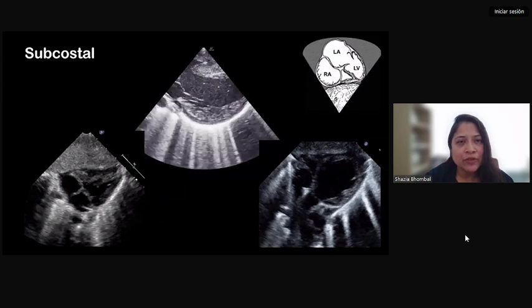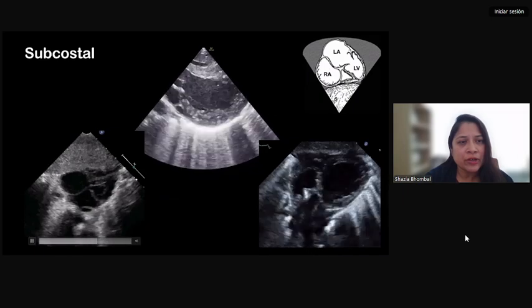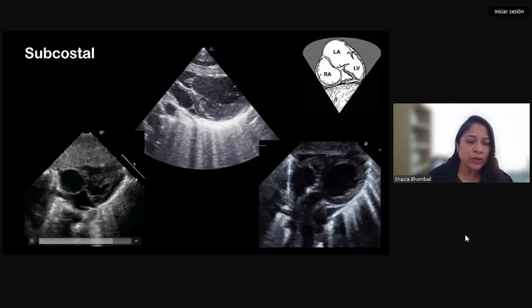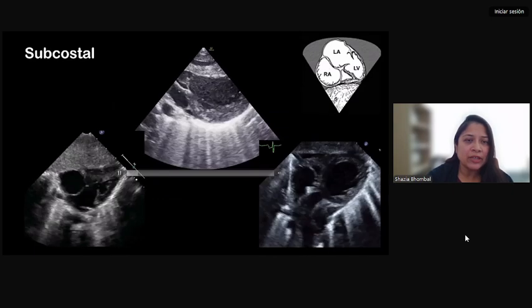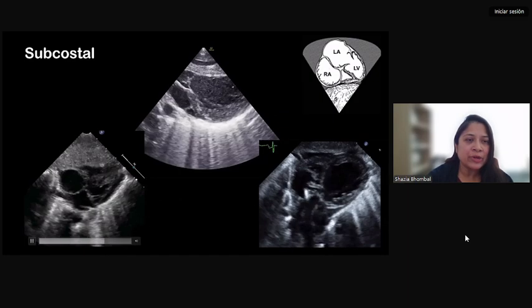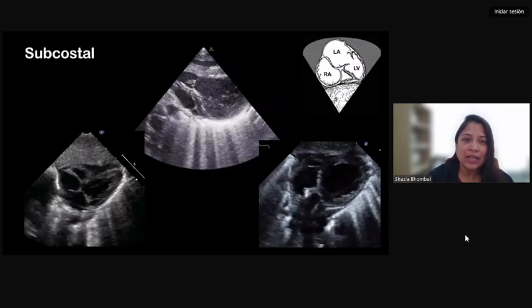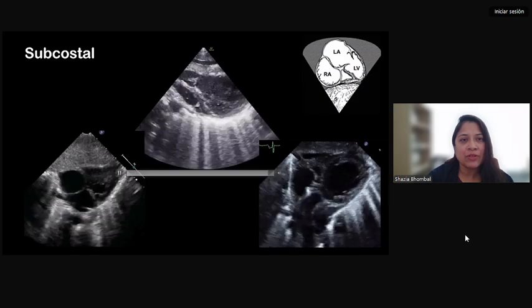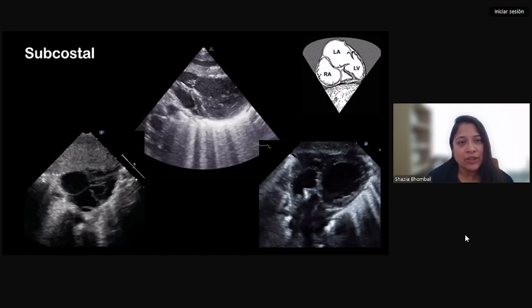And again, looking at another view, this is the subcostal view, where you have the liver here, inverted. In the cases where you are doing a quick exam, subcostal, when you're in a code situation, you can look to see, is the heart moving? These are examples of the heart not moving very well. Again, LV here, compared to a more normal left ventricular function, where the heart is squeezing. And you can also look for pericardial effusion, a big black ball around the heart. None of that you see here, but the more that we recognize normal, the more you'll recognize when things are not normal.